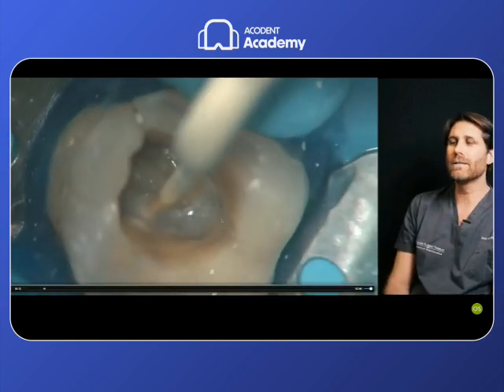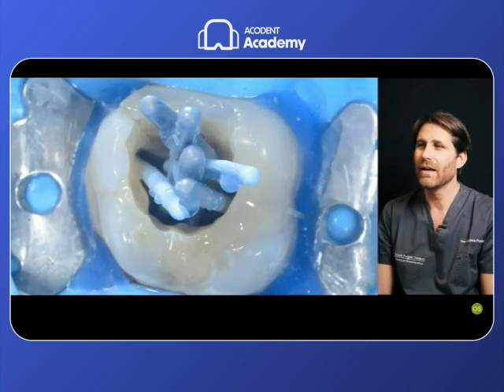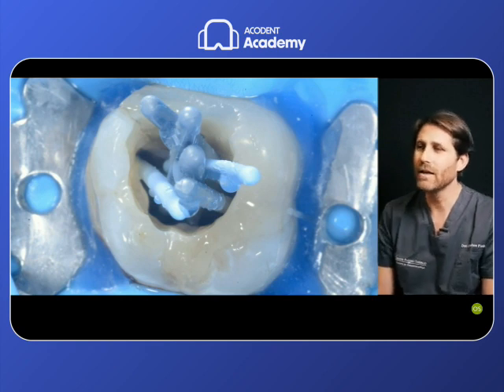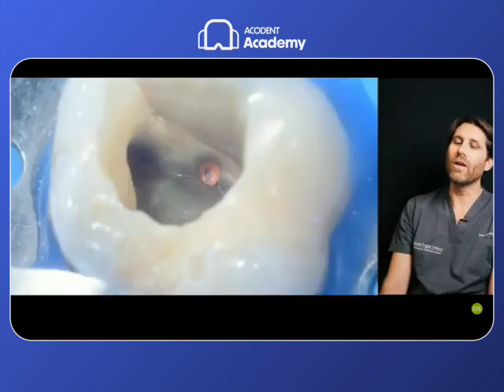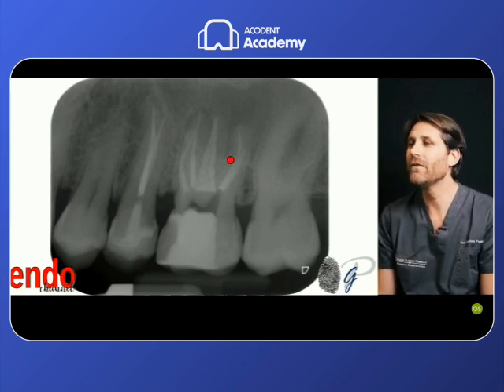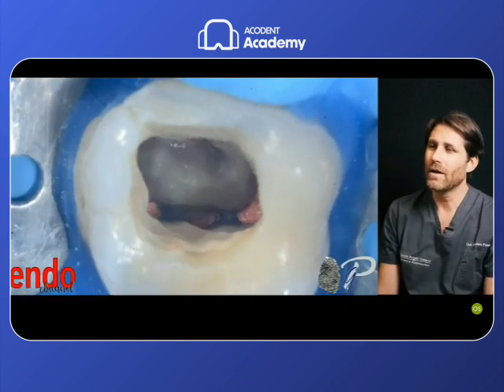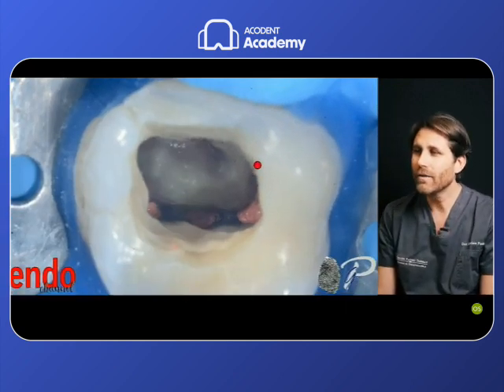So there were 6 root canals in this particular anatomy, filled again with the filling techniques. Those are the images after filling and the radiographs after filling these 6 different root canals of this upper molar. Those are the 2 distobuccal and the 2 palatal canals.